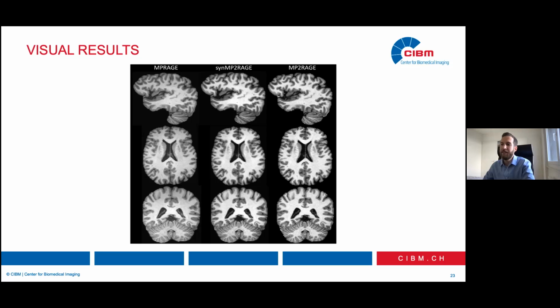But at the same time, it's interesting to see that somehow the network is probably learning to segment cortical lesions in a different way compared to human experts. So it's already able to segment them well on simple MP-RAGE images if they were labeled correctly. Our cortical lesions were labeled, of course, looking at the MP2-RAGE images, and then the segmentation was co-registered to the MP-RAGE ones. So this is also an interesting point.